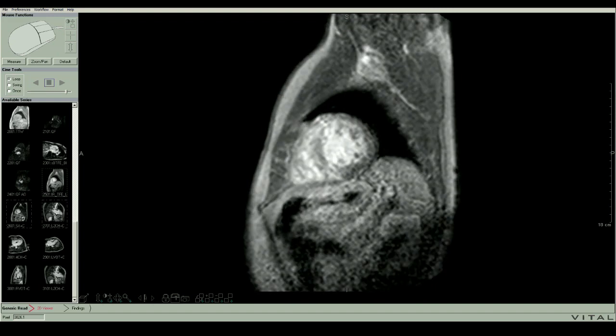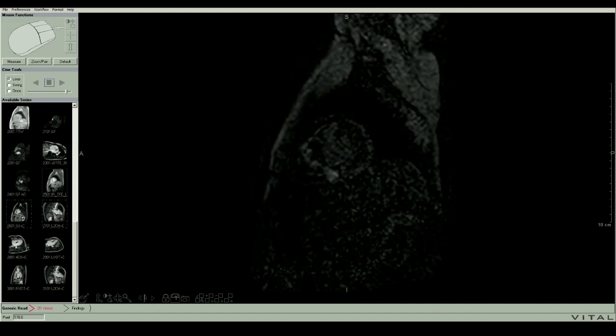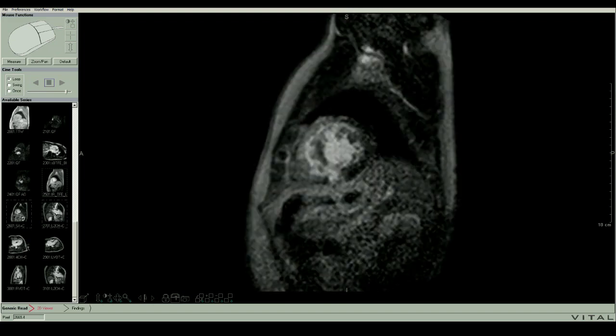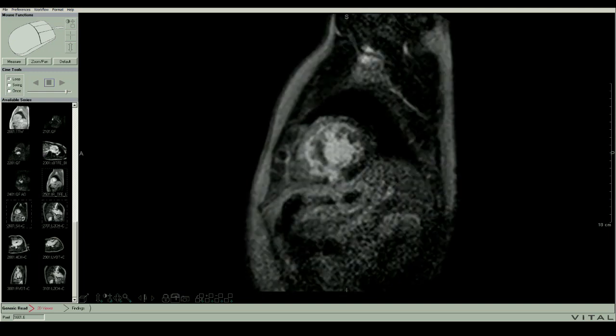So this is important. Looking at these early segments of something called the Look-Locker. This is the Look-Locker. So to be LL, when you look on the MRI, you'll see an LL. Look for the LL. When you find the LL, that's the Look-Locker, and that's before the sequences of late gadolinium enhancement. And there is gadolinium enhancement. It is there. Okay, so we know it's abnormal, but we are able to null parts of the myocardium.